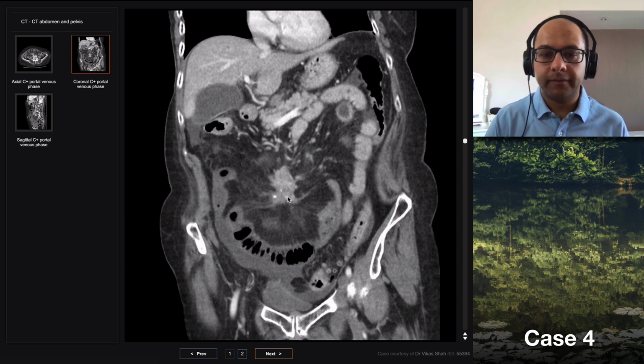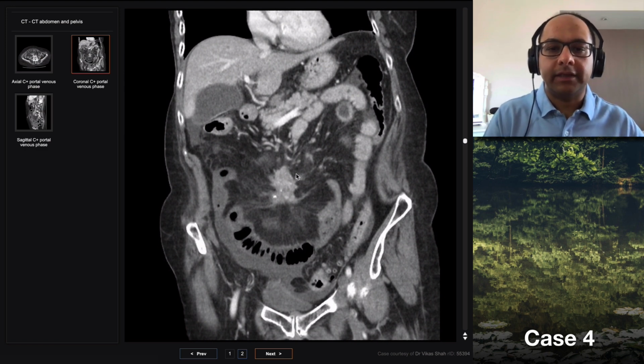So we would do a CT chest as well to finish the staging of the tumor. What kind of phase? An arterial phase chest. Okay, and including the chest and the upper abdomen till above the pelvis. Okay, yeah, so let's just talk through that.